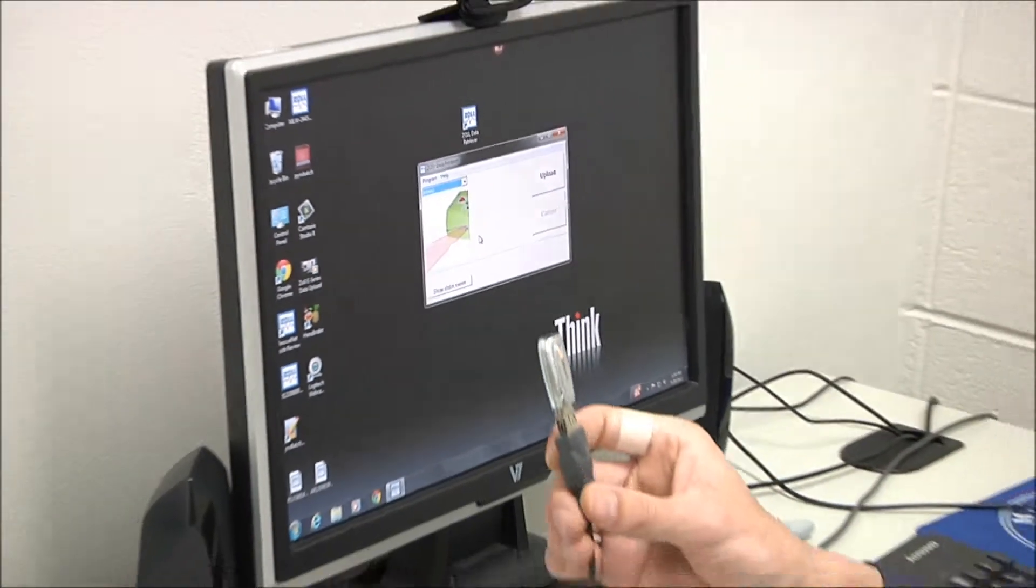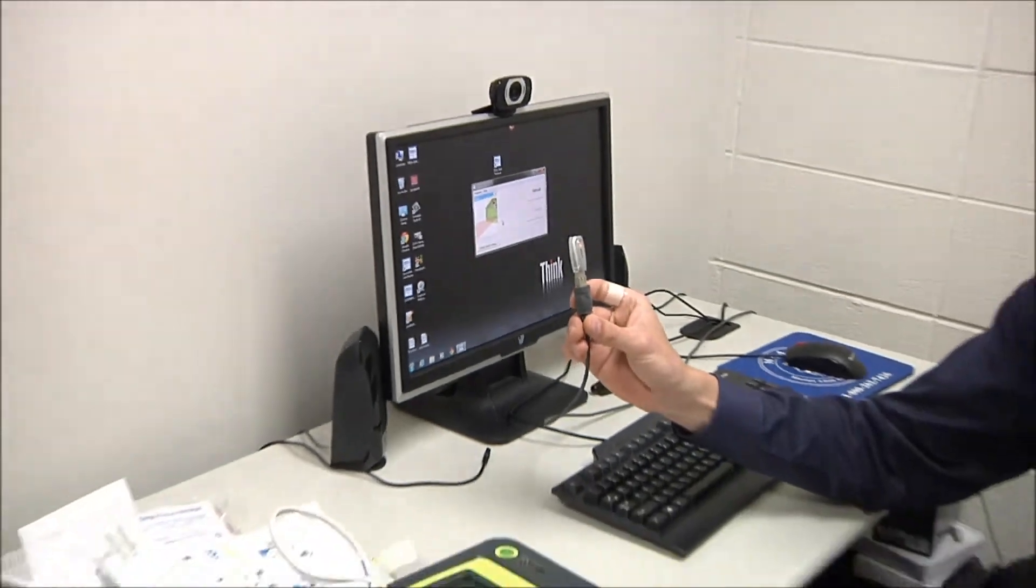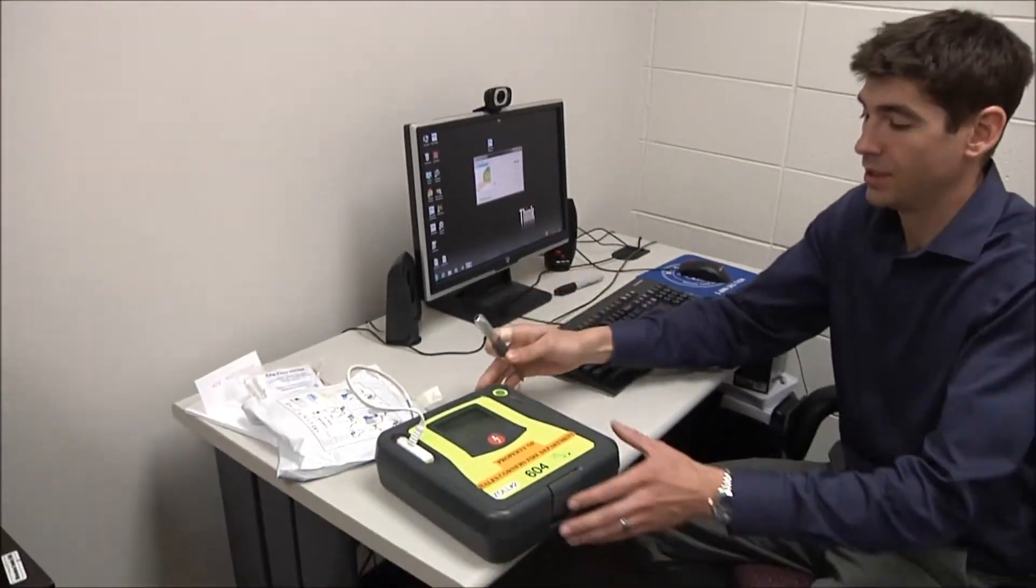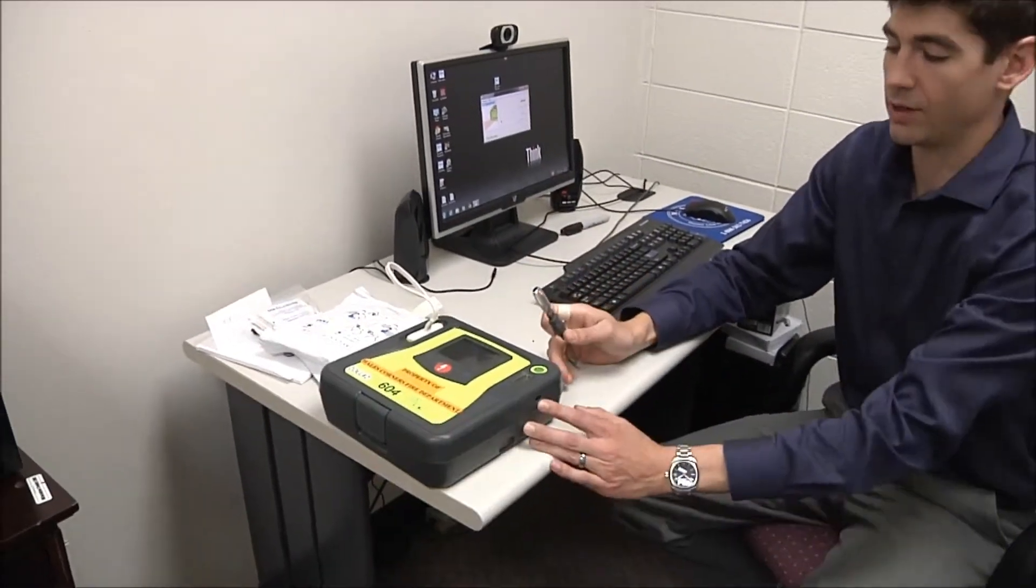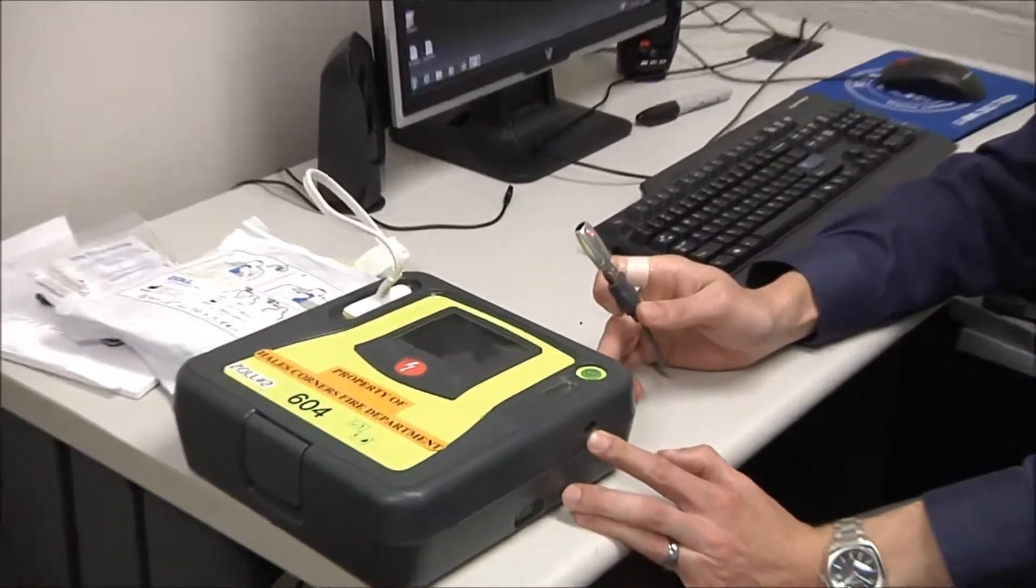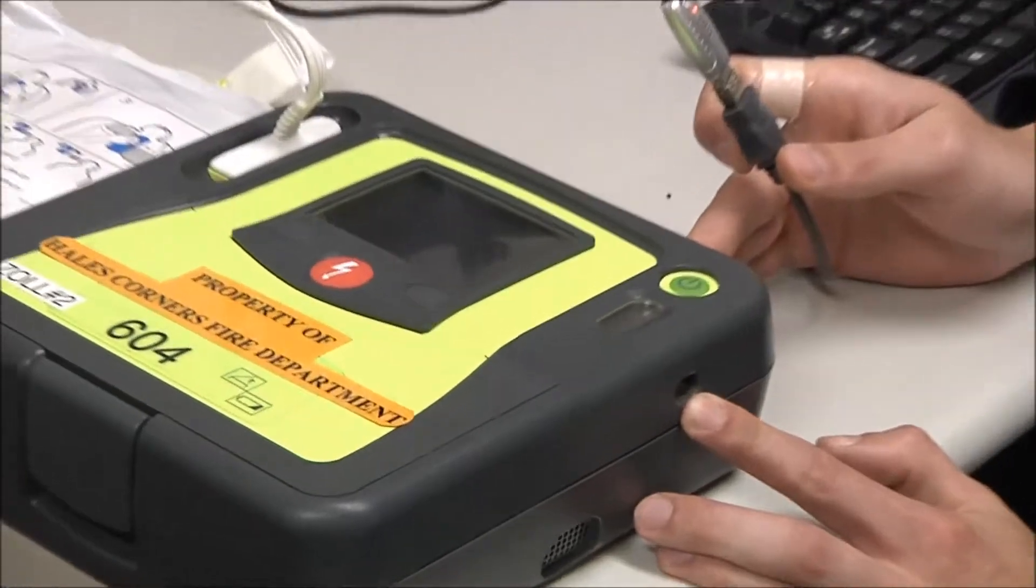And then the next thing I do is I'm going to take my infrared adapter and I'm going to hold it to the infrared port that's right here on the side of your AED Pro.